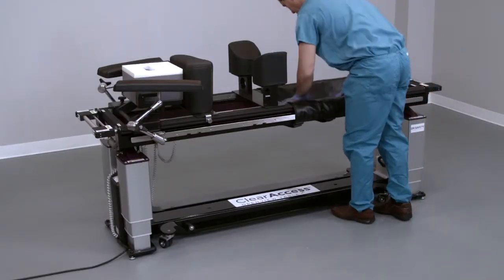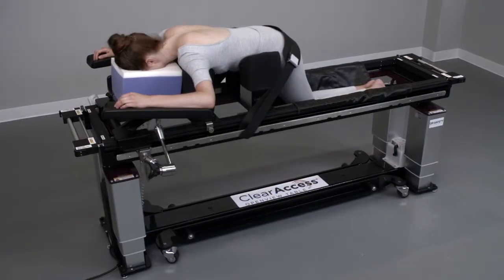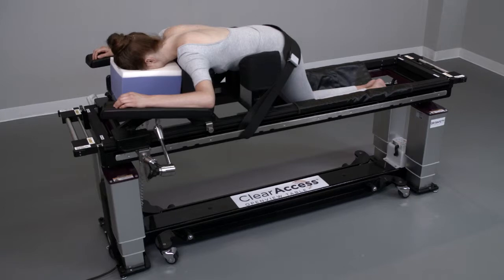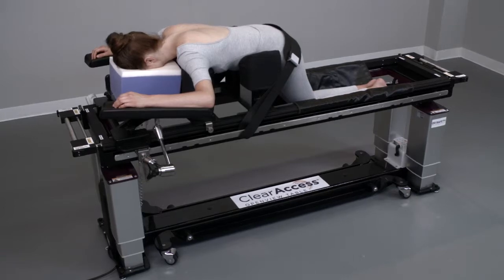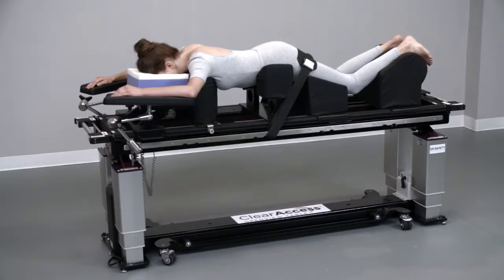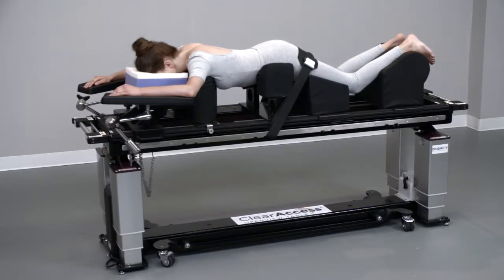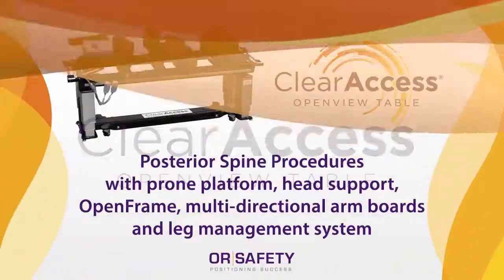Once the patient has been positioned on the table, use patient restraint straps to secure the patient to the table before draping and preparation for surgery. Adjust the open frame and arm boards as necessary for patient comfort and to minimize the risk of pressure marks on the patient. Please consult the ClearAccess instructions for use with any further questions.